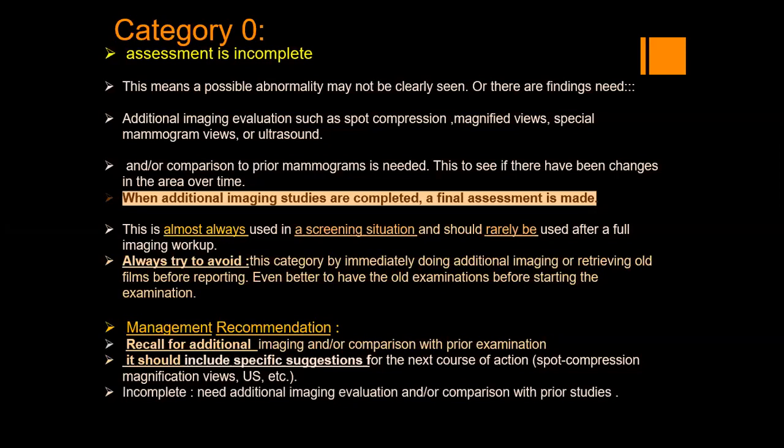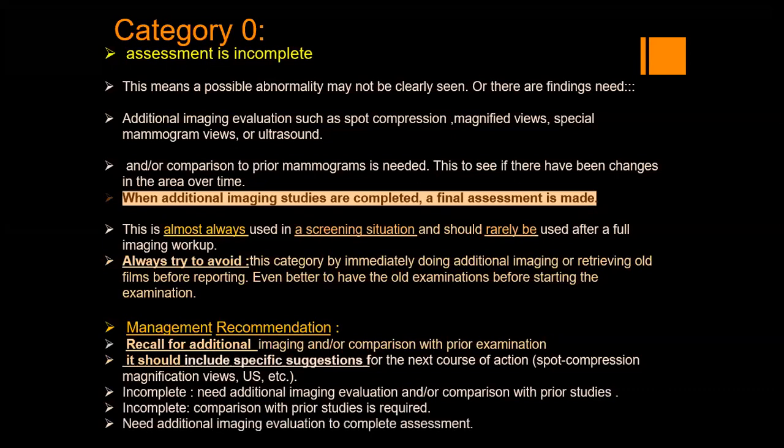So the terminology used can be: incomplete, need additional imaging evaluation and/or comparison with prior studies. Incomplete, comparison with prior study is required. Need additional imaging evaluation to complete the assessment. Any terminology, you can use it from this. Okay, when do we have to do BIRADS 0?